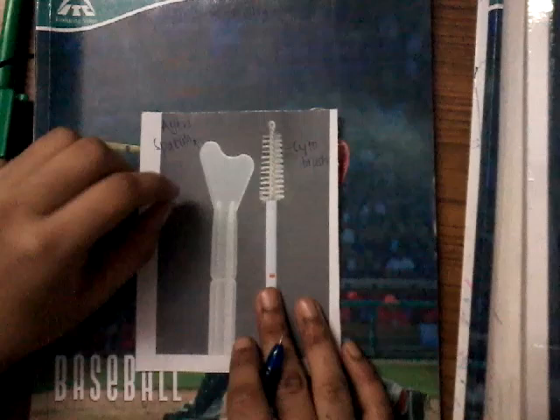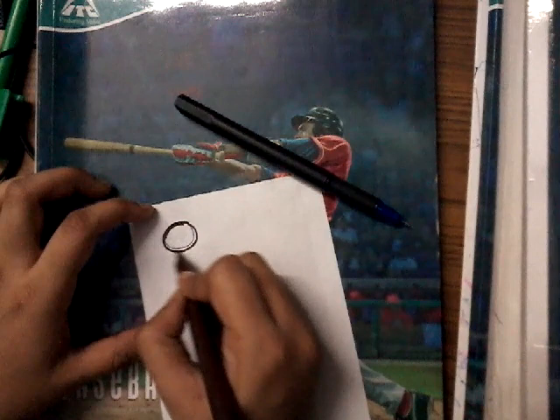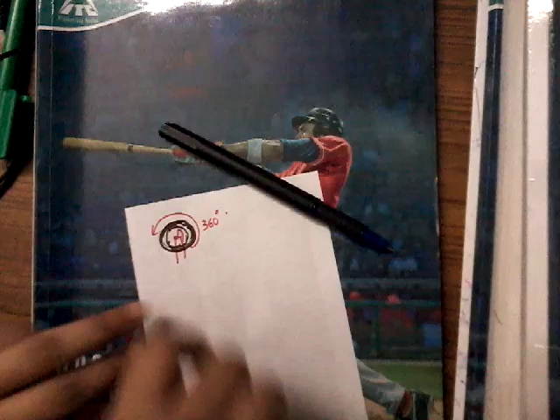If this is the cervix, we introduce the speculum and open it. Once the anterior and posterior vaginal walls are retracted, we introduce this spatula into the squamocolumnar junction. Once the spatula is introduced, you rotate it 360 degrees.